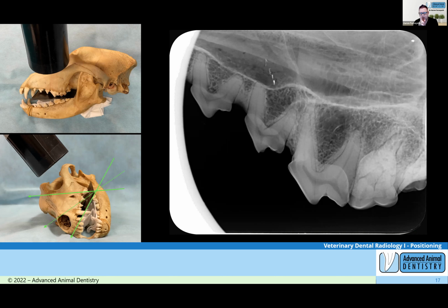But importantly, going back to what you mentioned about these larger size 4 plates and using them for surveys, teeth at either end of this plate are not necessarily fitting in a bisecting angle. And so that's why they may be distorted. So we're not necessarily going to get those guys dimensionally accurate. Yeah. So for those ones, if we've got a brachy, I'll often drop down to a size 2 plate so I can hone in a little bit more on the anatomy.